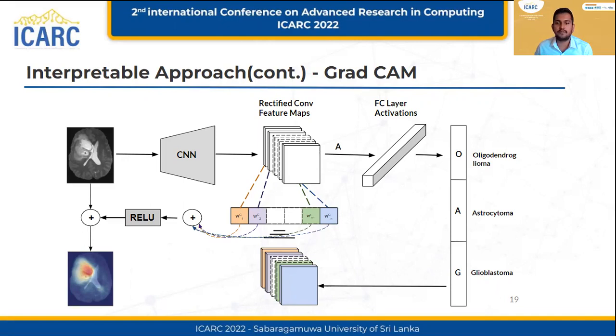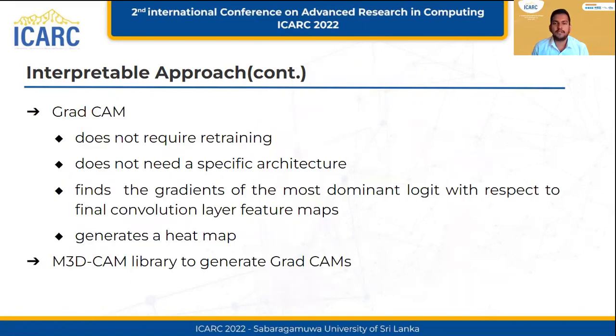Then the result will be scaled up to match the dimensions of the input image. Then this heat map will be superimposed on the input image to make it more human understandable. When compared to other interpretable approaches, GradCam does not require retraining, meaning GradCam is applied to trained models. Also, it does not require a specific architecture.